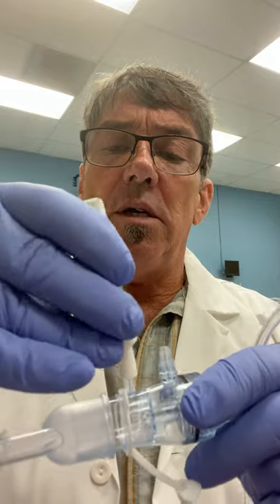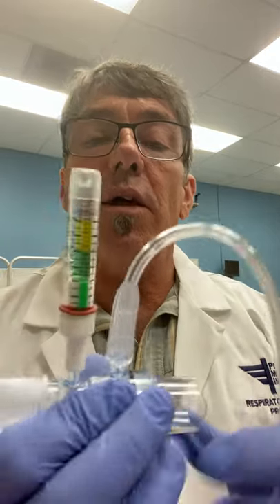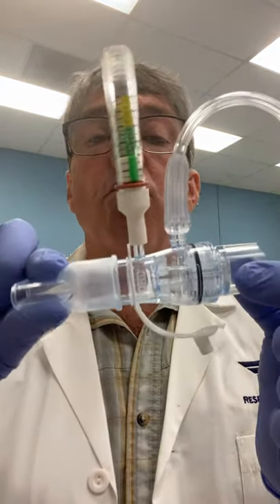The EZ-PAP comes in a disposable package. It has a mouthpiece. It has an effort manometer that's a separate device that we go ahead and put on that small connector there. And then we have the larger connector that we connect to oxygen tubing. The oxygen tubing is in the packaging, so we just pull that out, connect that there, and the EZ-PAP is ready to go.